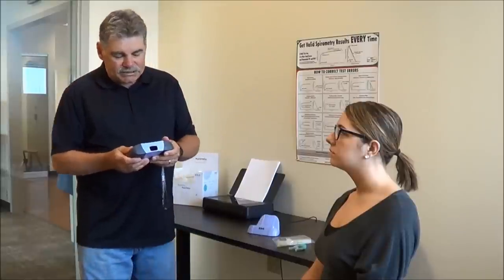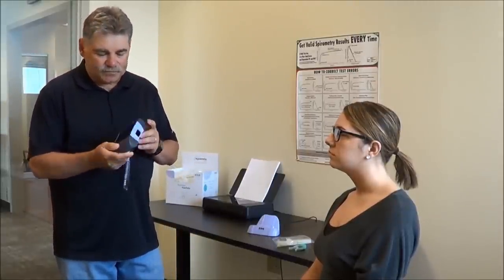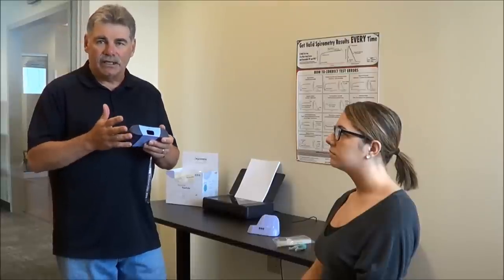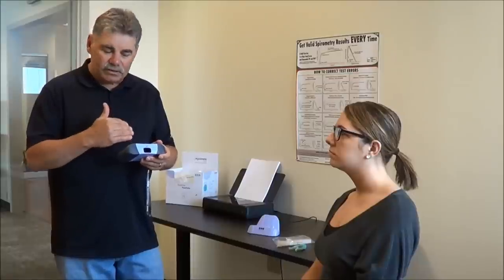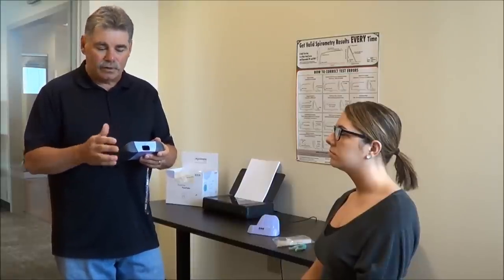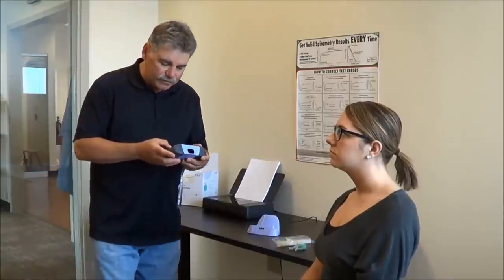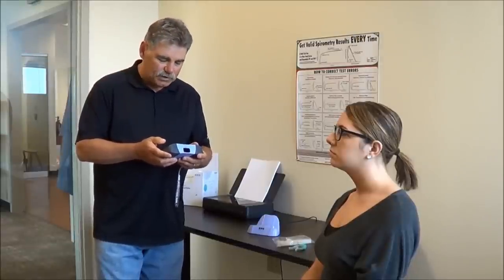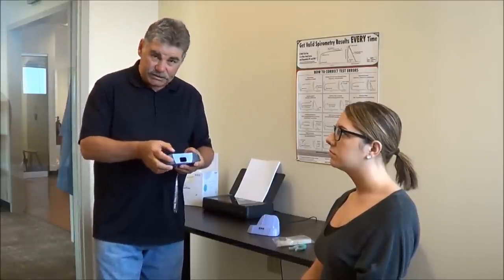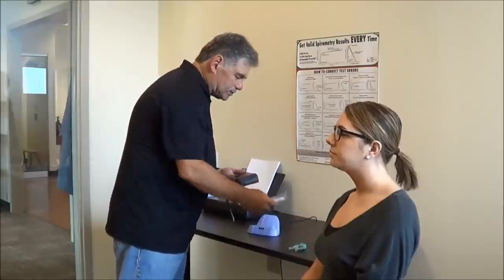The first screen I see allows me to either add a patient or choose a patient that has already been added. If you're adding a new patient, it's important that the age, sex, height, and ethnicity be entered correctly. However, if the patient is already entered, you can simply select them from the database, and there are sort and search features available to do that. In this case, I'm going to choose Tina, who's already loaded.